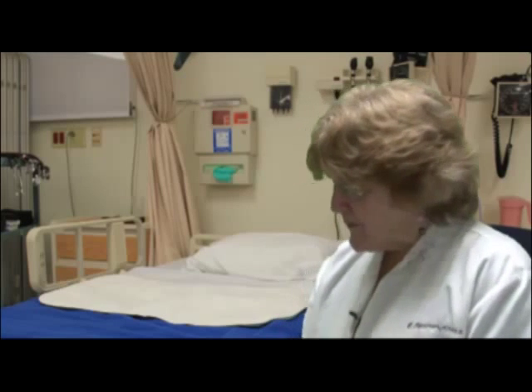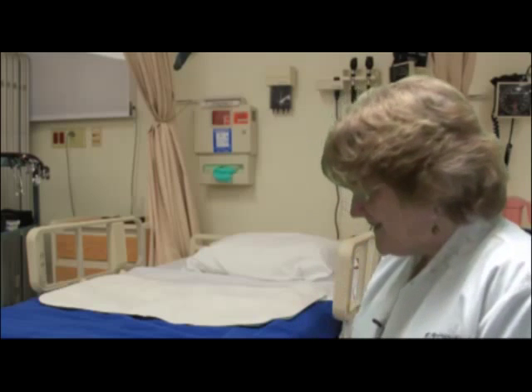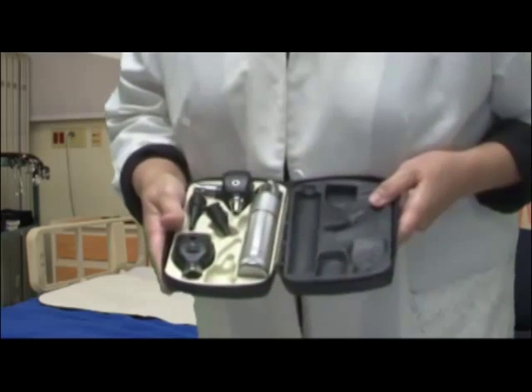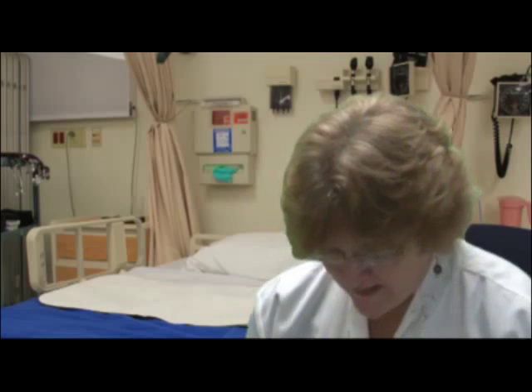Okay. Well, today what I'm going to do is look at your head, your eyes, your ears, your nose, and your throat. So to do this exam, I'm going to need inspection. I'm also going to need an ophthalmoscope and an otoscope. And so students, you can get that either on the wall and turn on the scope, or you might have to have something like I do, which is a portable one that you have to put together. And in some of the clinics, we have to put them together. So I will show you how to do that in a few minutes.